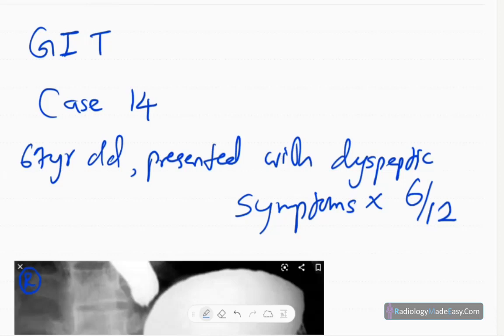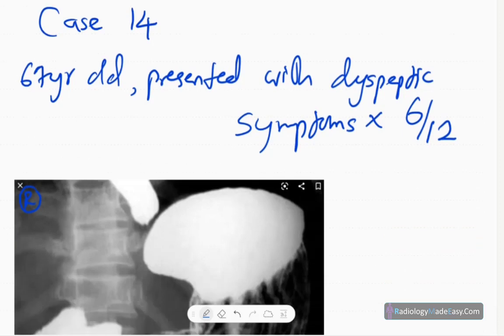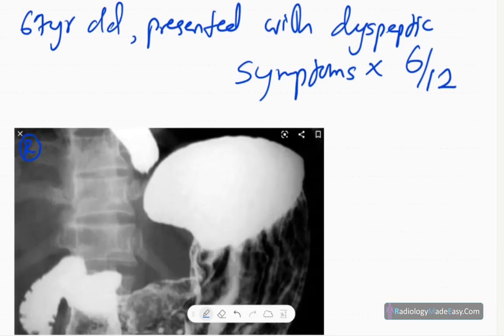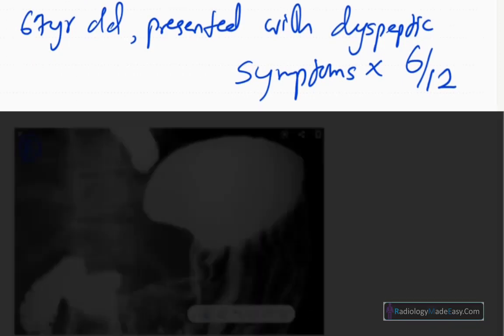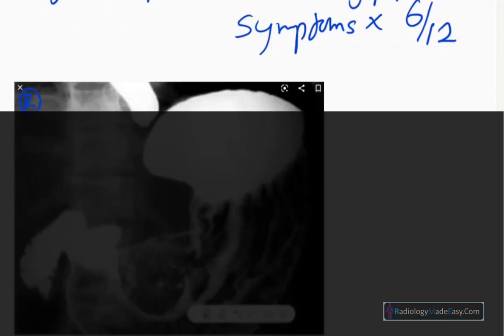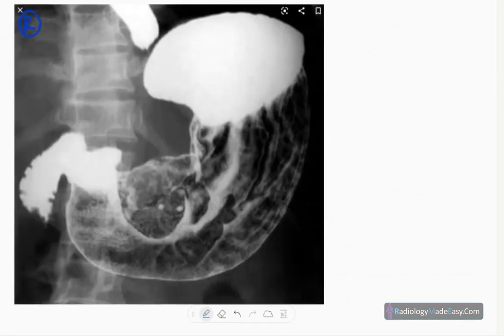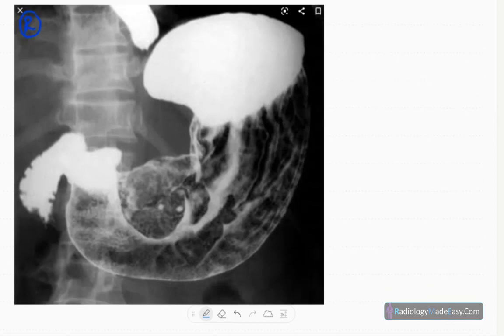Welcome back to case number 14 in GIT contrast studies. Today our case is a 67-year-old patient presented with dyspeptic symptoms for six months duration. This is the anteroposterior spot radiograph of the barium meal series.